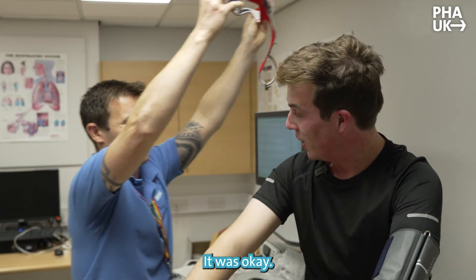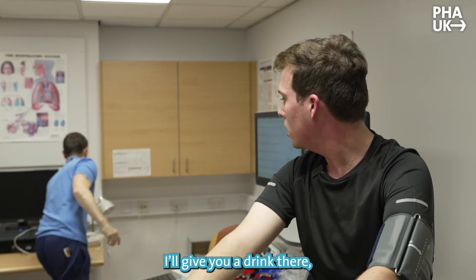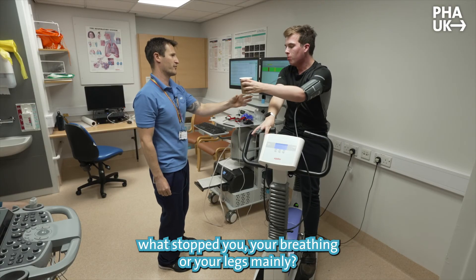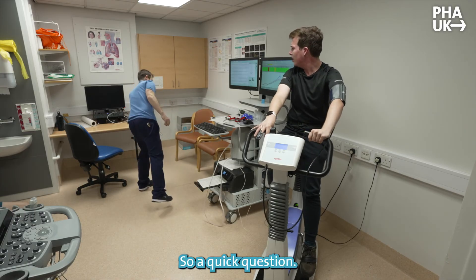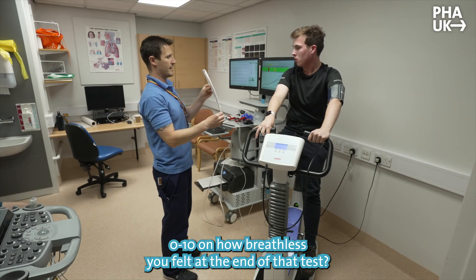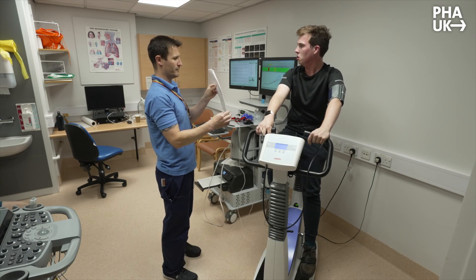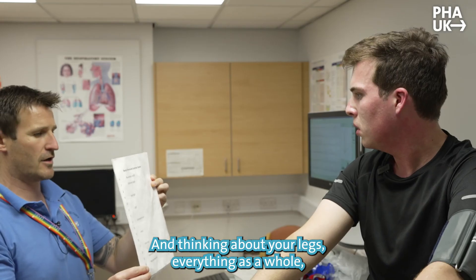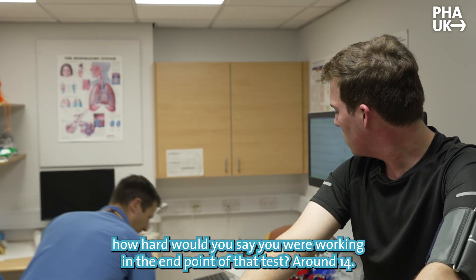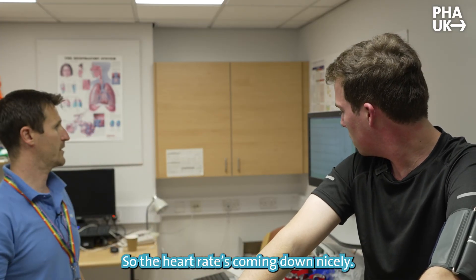How did you find that? That was okay. Could I have a drink please? Yeah, there you go. At the end of the test, what stopped you — your breathing or your legs mainly? My legs. Excellent. On a scale of nought to ten, how breathless did you feel at the end? Around four or five. If you had to pick one — four. Excellent. And thinking about your legs and everything as a whole, how hard were you working at the end? Around fourteen. Excellent.